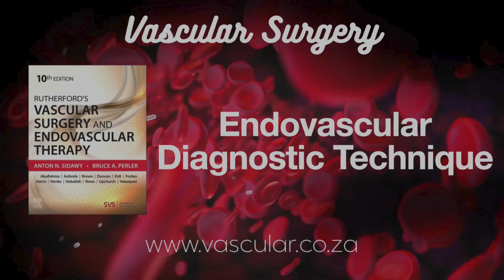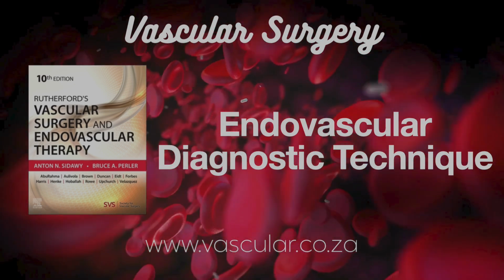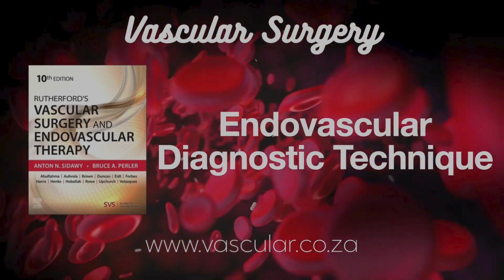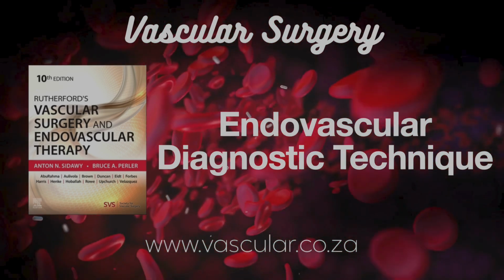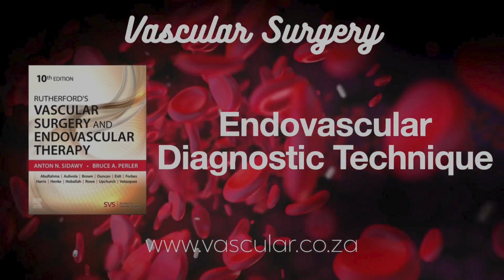We also heard about crossing catheters. Right, these are built differently. Low profile, quite stiff, often with a tapered tip. Designed for? Getting through tight narrowings, stenoses, or even complete blockages. Mostly used for interventions, obviously, to cross the lesion before treating it. But useful for diagnosis sometimes. Can be, yeah. If the spot you need to image is beyond a really tough narrowing, a crossing catheter might be the only way to get there diagnostically.